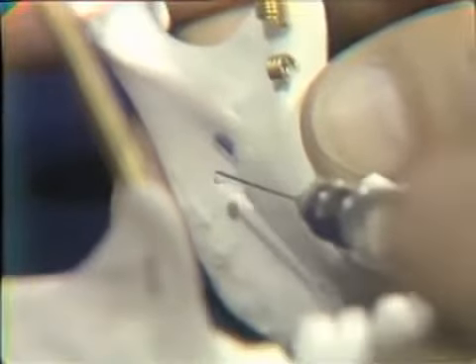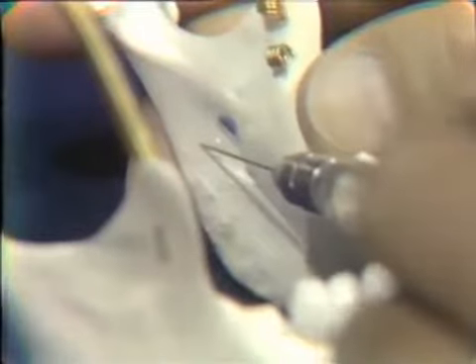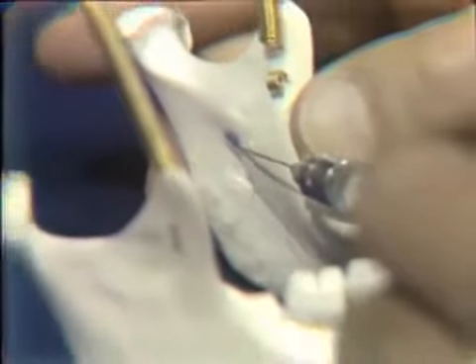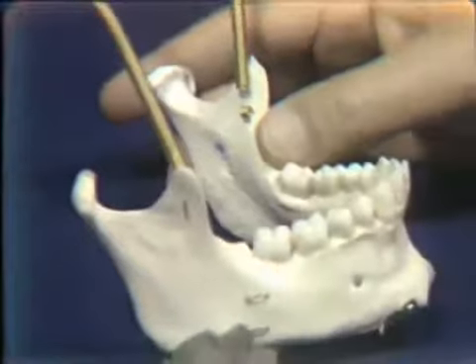And we carry on in and then attempt to get the needle bevel against bone with a light touch, approximately 2/3 of the distance from the anterior to the posterior border. Then we would aspirate naturally and inject the solution slowly, which we will demonstrate on the patient.